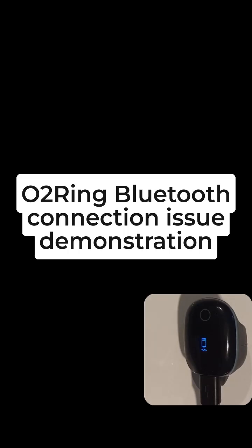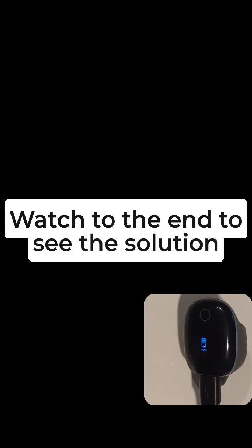Sometimes the O2 ring does not connect to the smartphone. Here is how it looks.